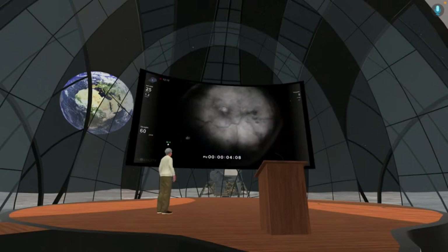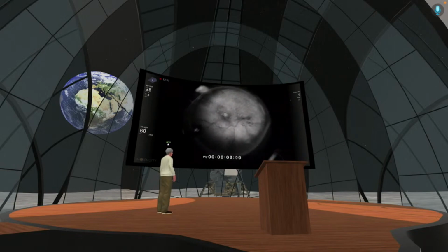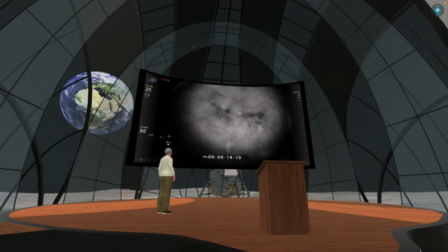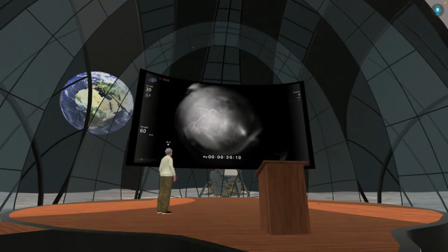Now, this is a case of hemophthalmos, and here there will be intraoperative endodiathermy guided by the fluorescein angio, because that way we can really see from where the leakage is.